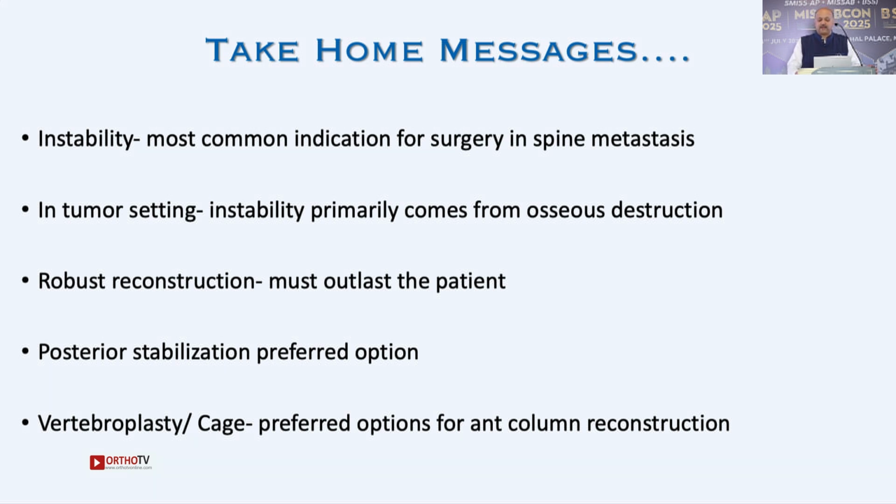In the tumor setting, instability primarily comes from osseous destruction, not from ligamentous destruction. Robust reconstruction should be planned. Don't think of small things. Here, you want to give this patient one surgery. One surgery which will last his lifetime till he dies, that surgery should exist. Otherwise, you have not done justice to this patient.